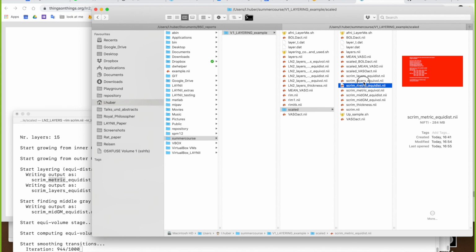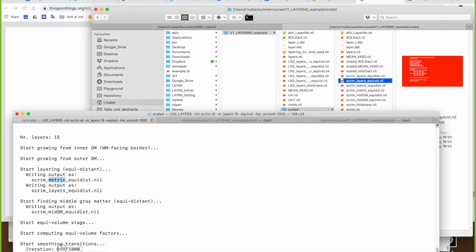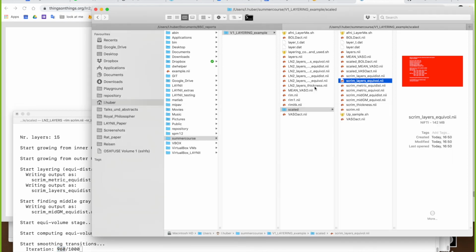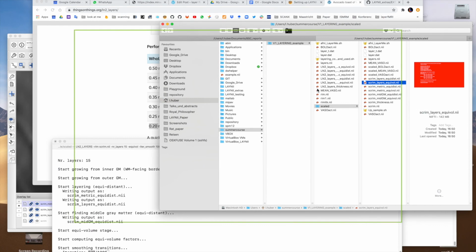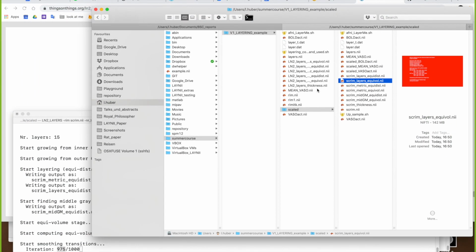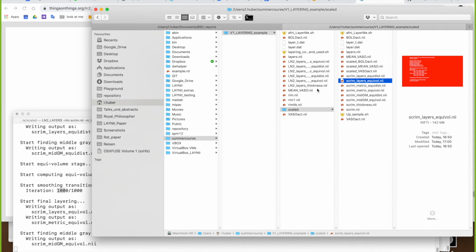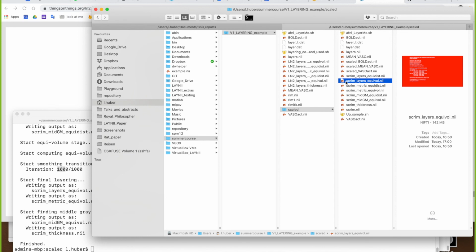Our idea is that we always want to have the 2D option available, and partial coverage, so all the programs should work there, and also for whole brain coverage too. This is our approach. And we try to always make the commands the same across all these different images, like 2D image, partial coverage, very small region of interest image, or a whole brain image at several resolutions.